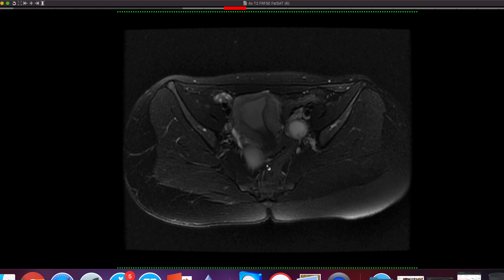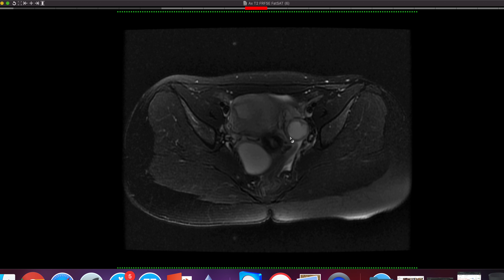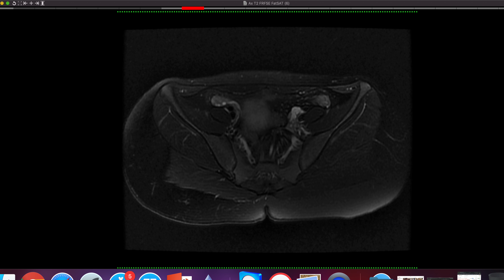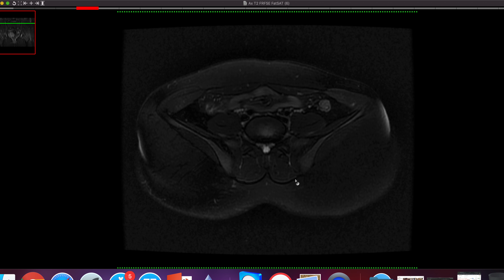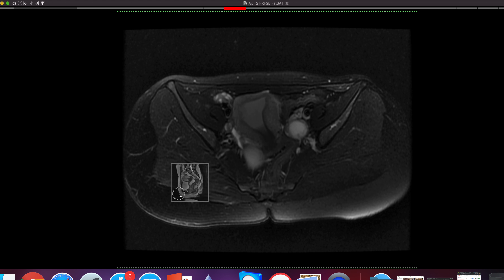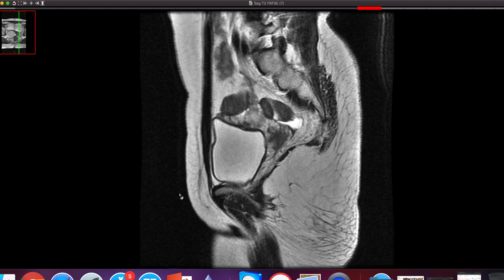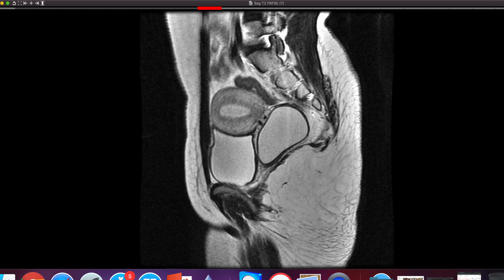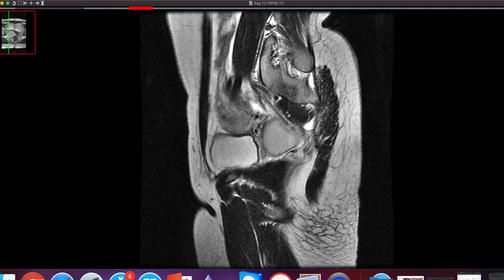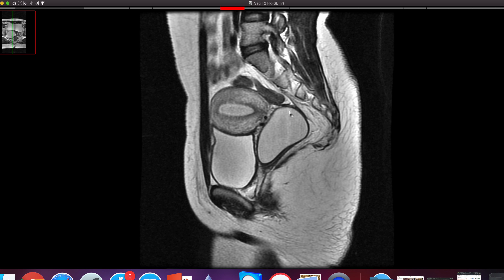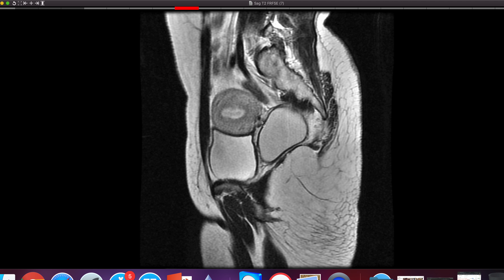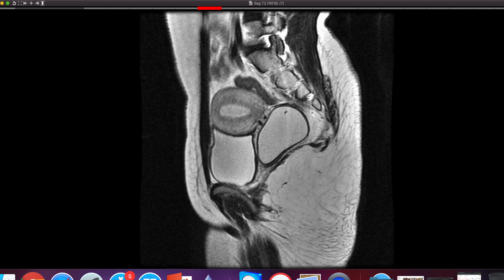Both ovaries are normal; a follicular cyst was seen in the left ovary, and the uterus has a normal contour. The cyst is insinuated in the fornix and is related to the posterior wall. It is very well-marginated with a very well-defined cyst wall.